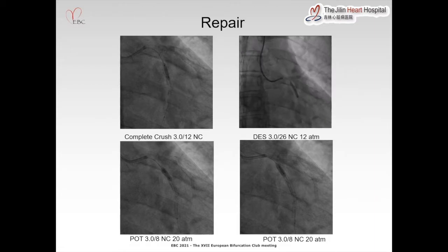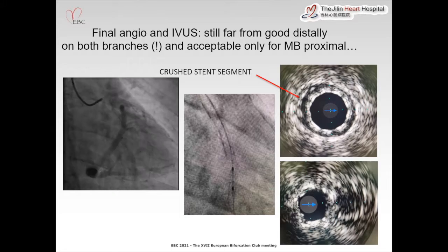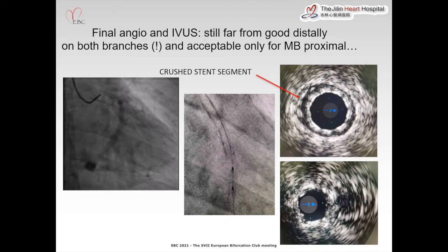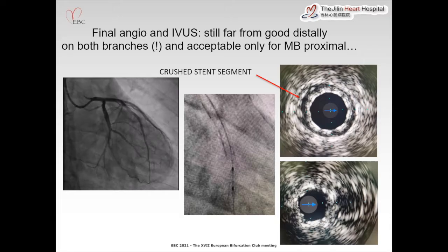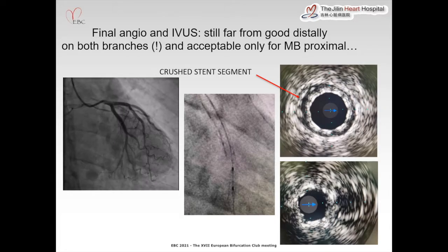But this was not completely successful in repairing what happened at the bifurcation and at the origin of the two side branches. You see the result also with another stent boost is ugly, terrible.